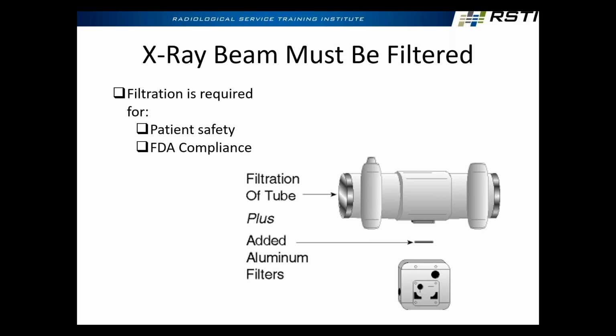Right? So those filters, sometimes they're right in the collimator, sometimes they're up in the port of the tube, sometimes they're adjustable on things like the Definium 8000, XR656, some of the GE rooms. You can select right from the console, and you'll hear these little solenoid-driven filters move in and out inside the collimator. In that case, they do something a little bit different.